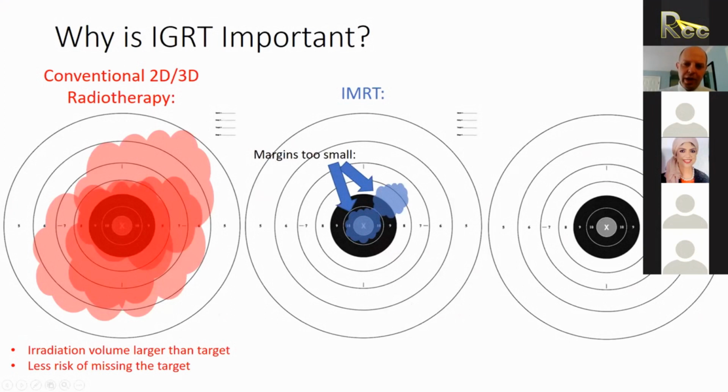So you have to be very careful and instead maybe paint a larger dose distribution. Then maybe we're able to paint a smaller one, but we have to build in some uncertainty based on the uncertainty of the setup, depending on our immobilization technique and all of those details and location in the body.